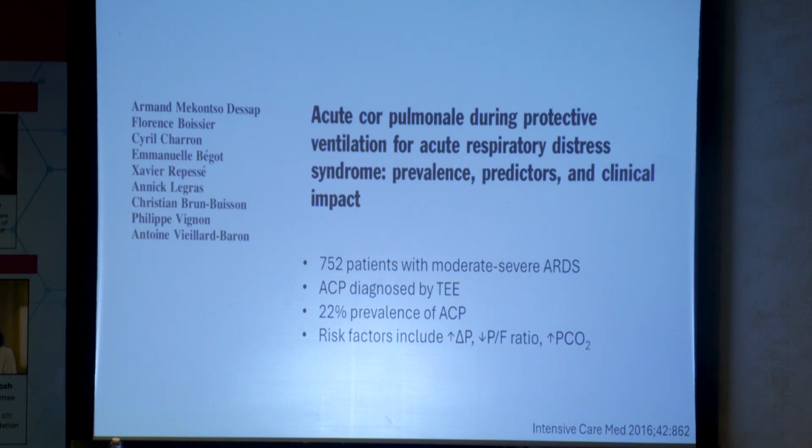That being said, because I am not trained as a surgeon, that's one of the reasons why I have not chosen to pursue becoming a cannulator, because some of the problems you can create as an ECMO cannulator require a surgeon to fix. And I prefer having the surgeon involved from the beginning than calling Raghu saying, I'm in trouble here. There's a big hole in the vein that won't stop. Can you come and help me?